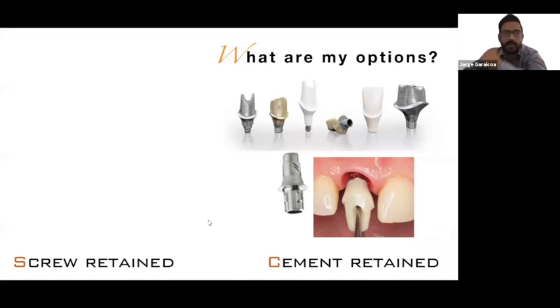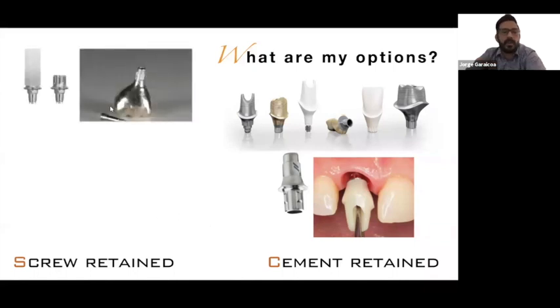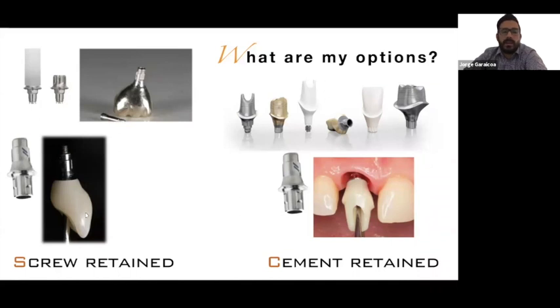Absolutely, absolutely. Actually, that's part of my next slide. But in the screw-retained options, remember that we had the typical UCLA design. I used this design a lot during residency. But I see a decline of the use of this restoration, particularly because of the cost of the metal nowadays, right? So most of the times I see zirconia crowns or another type of restoration, which actually is done in a different way as a screw-retained restoration. So you can either mill or sometimes press lithium silicate to these structures, and then the whole structure is cemented outside the mouth, and then you can just do it as a screw-retained restoration. There are multiple combinations, of course, but this is mostly, I think, what we see.